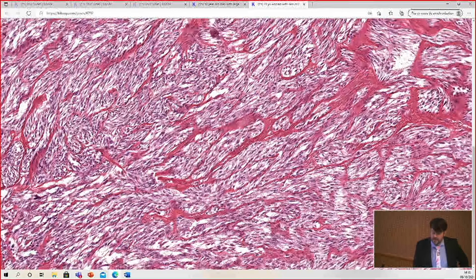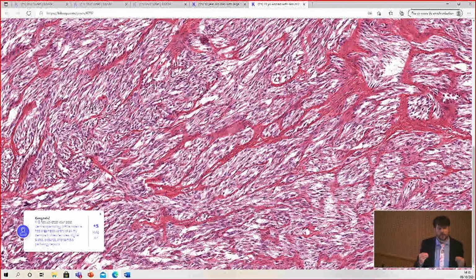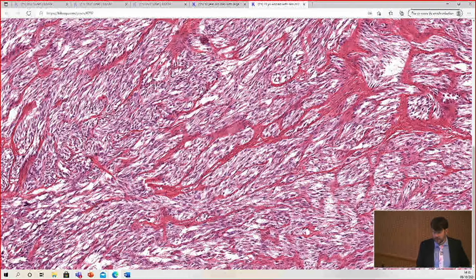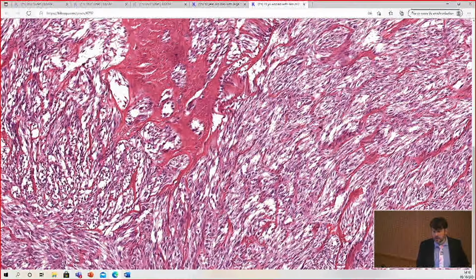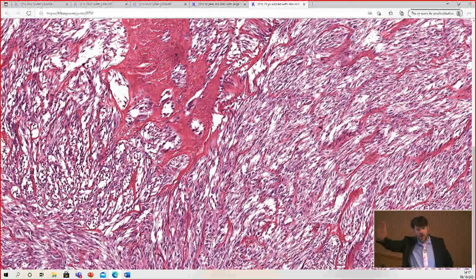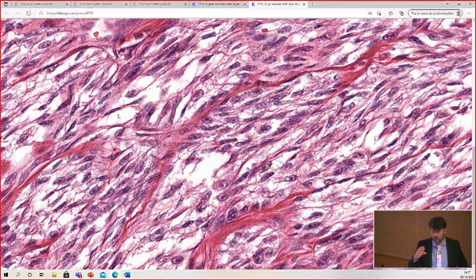If you cut them longitudinally, they look like long fascicles of plump spindle cells. If you cut them in cross-section, they look more like nests. So it is a matter of three-dimensionally whether it's cut long or across. The cells are relatively uniform. Their nuclei are oval and all look like each other. That is a general feature of most translocation-associated neoplasms, particularly in soft tissue pathology. If there is a balanced rearrangement or a gene fusion, usually the tumor will have nuclei that all look alike because they all have the same molecular event driving the tumor.